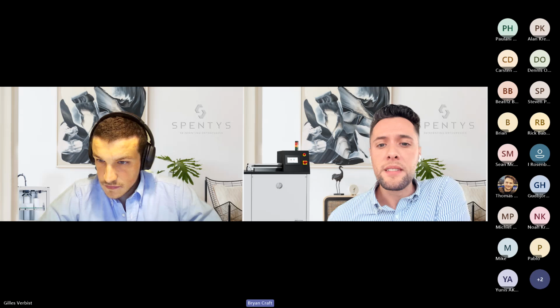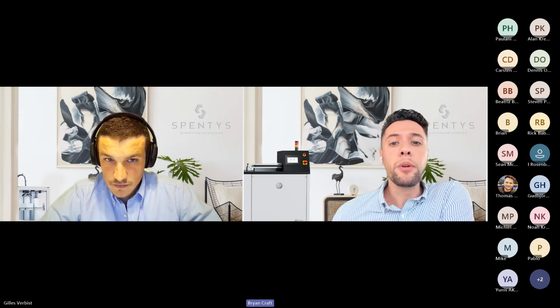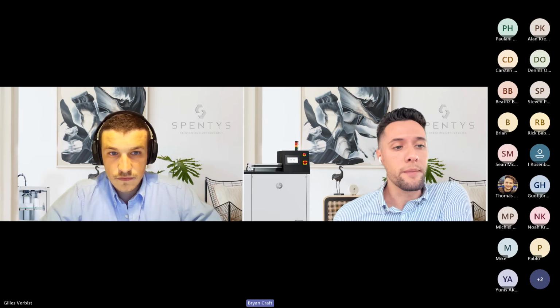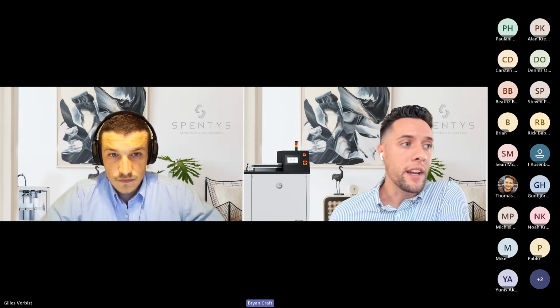Can I market the devices by showing the printing process here? Yes, absolutely. Now, 3D printing custom-made AFOs, I would recommend to fall within some validated parameters. I know there's a lot of movement right now for people to try to print with FDM printers as materials are advancing.